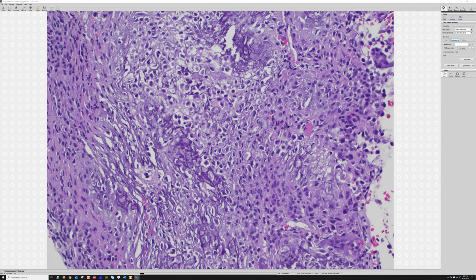And also if you shouted out Langerhans cell histiocytosis because of the bean-shaped nuclei, that's not a bad idea. The nuclei of this tumor, which is chondroblastoma, can look similar to Langerhans cell, but in Langerhans cell you'll have eosinophils and a mixture of background inflammatory cells, and then usually the radiographic findings are going to be a bit different.